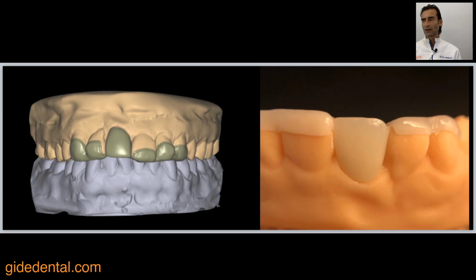This is the surgical guide that we have made for that patient, so it really looks good. It's stable on the adjacent teeth. And again, we're maintaining the gingival margin the way the patient has it right now, because we are always thinking that we will, for that patient, lengthen the number 8 tooth, the natural tooth.